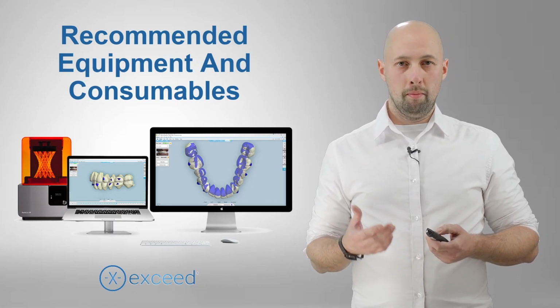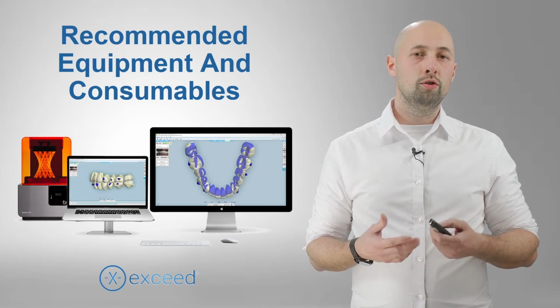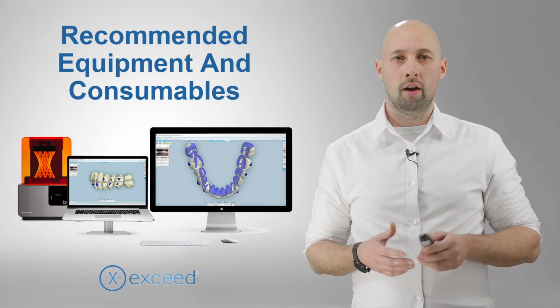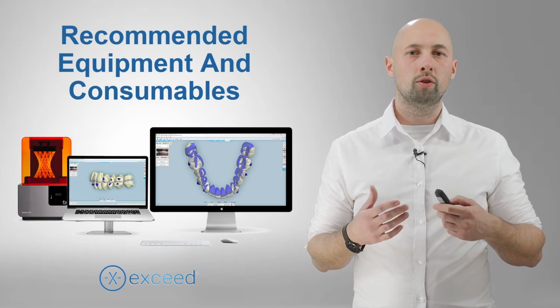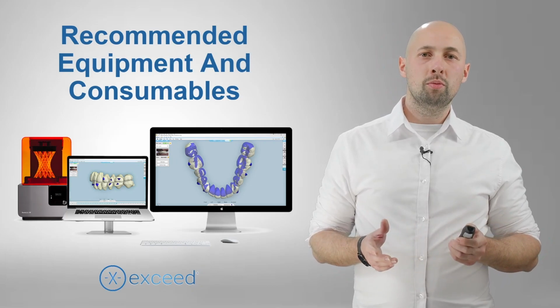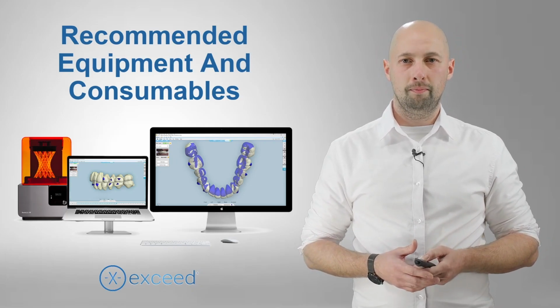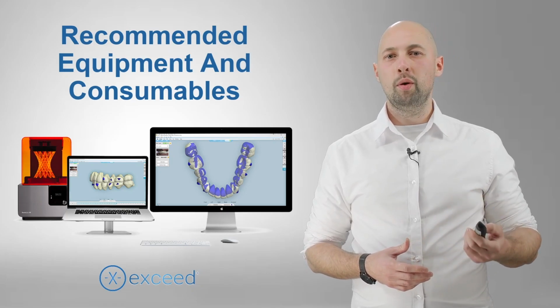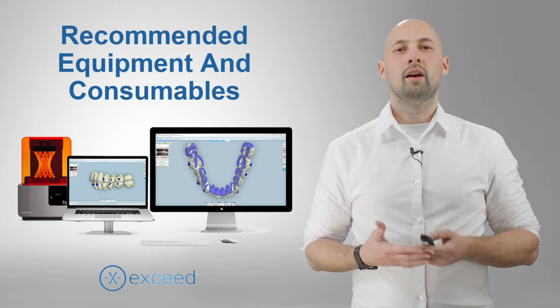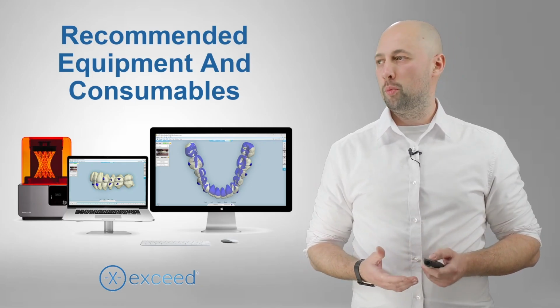And you will need the micromotor to cut it and to polish it, if you produce your aligners manually. You can also produce your aligners using the automated solutions, but we will talk about it a little bit later. Last but not least, you will need the management system, which is necessary to manage the cases you have in your pipeline. By investing in the right equipment, you can ensure that you have the tools you need to produce high-quality aligners and provide the best care possible for your patients.